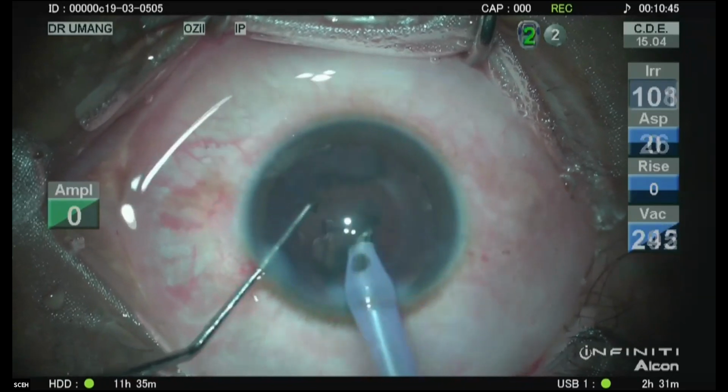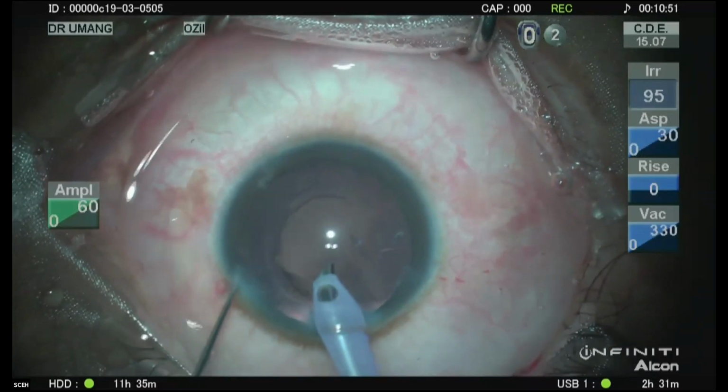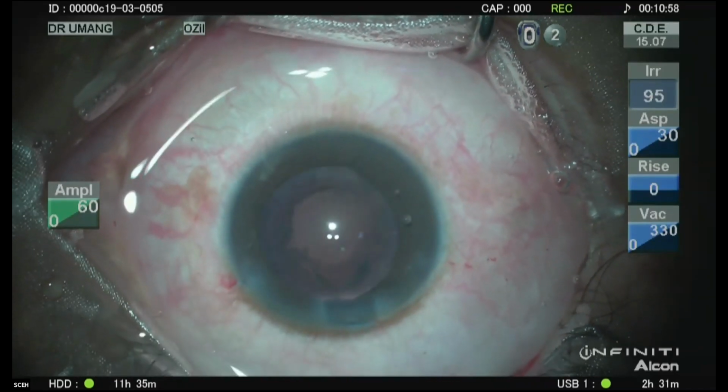This is the epinucleus. So always the second instrument comes out first, and only then the probe comes out.